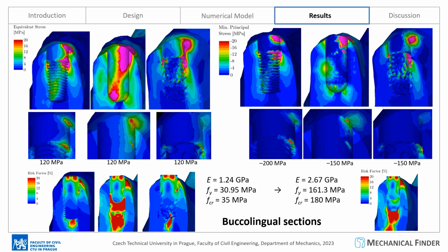As you can see from the image on the left bottom, the risk factor for the homogenized variant is peaking over 20%. The peak is at about 50%. So the initial design of the gyroid structure would have to be modified to have slightly larger modulus.